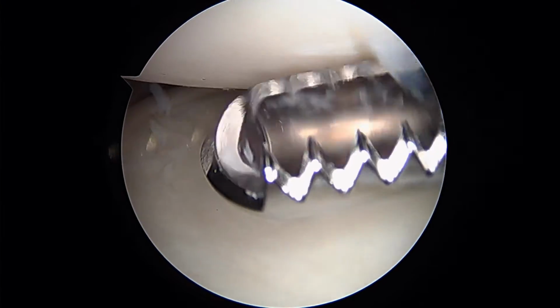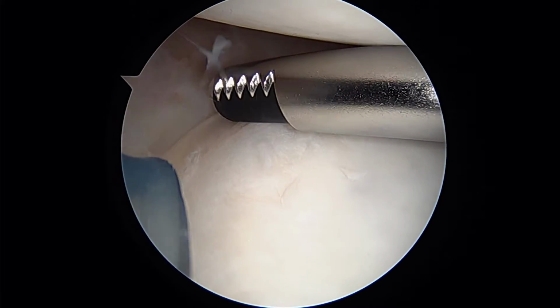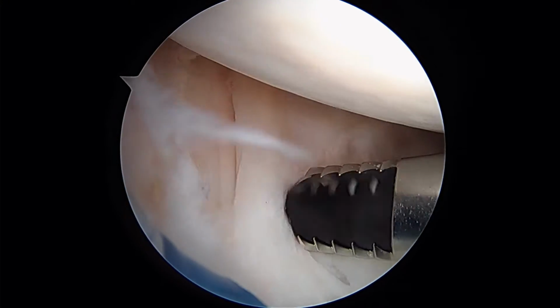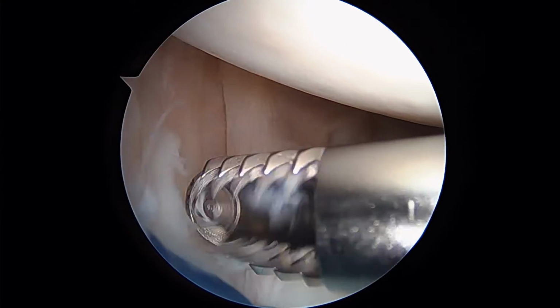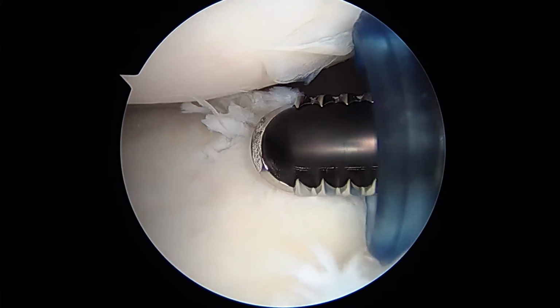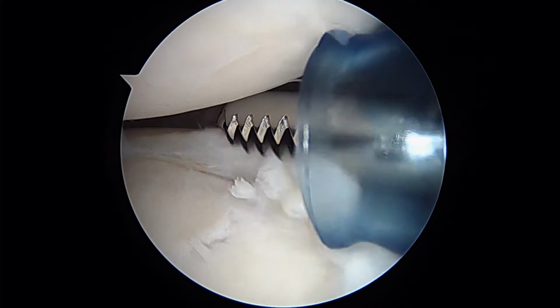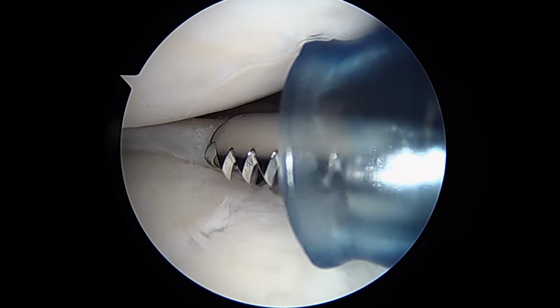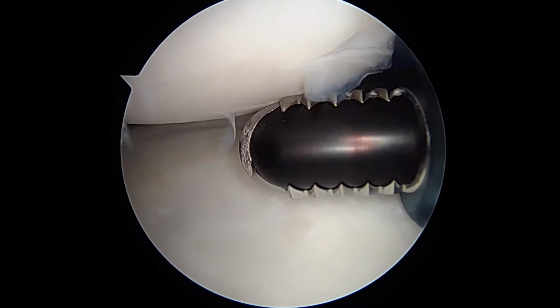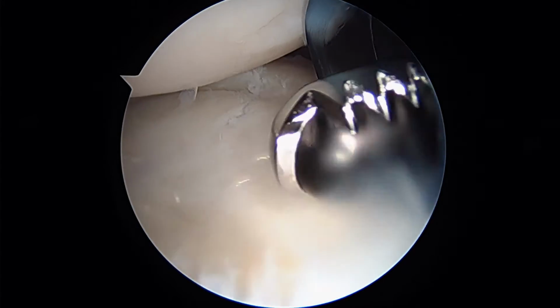We're just getting started on the right shoulder. We're actually looking from the front already, from the front towards the back. The reason is that when we examined your shoulder once we had you under anesthesia, it was pretty unstable towards the front. Now, as I look in here, I'm seeing a lot of damage towards the back, at least in the labrum, and that's what we're smoothing out right now. But your shoulder was dislocatable anteriorly, and so we're going to work on this. We're certainly not going to leave you like that.